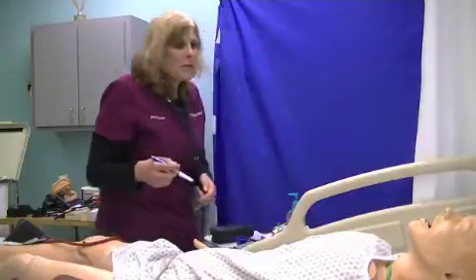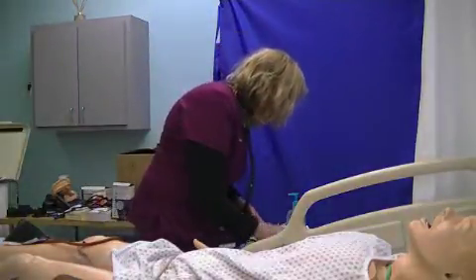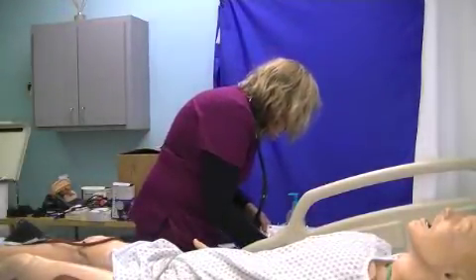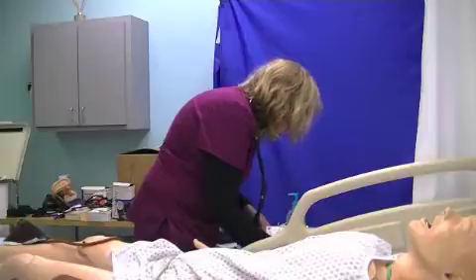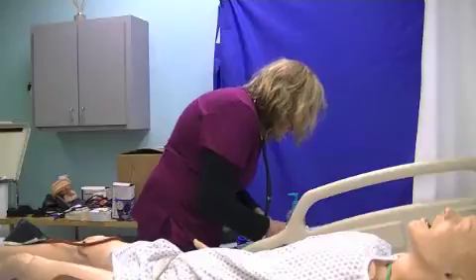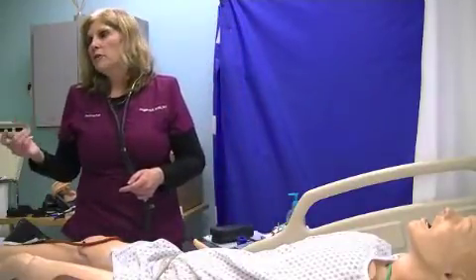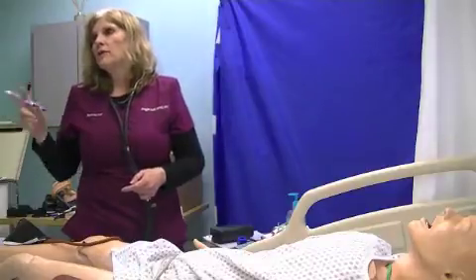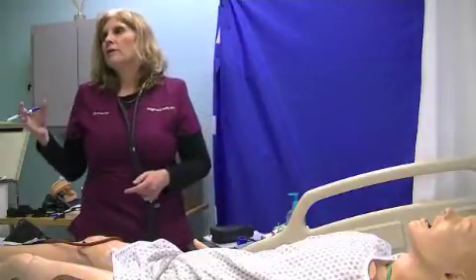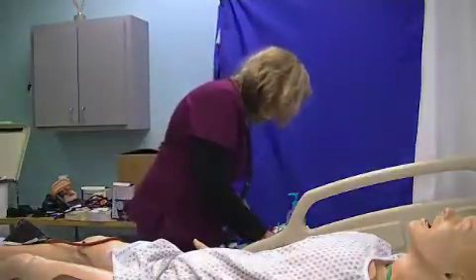Since this is the first time I saw you, I took your blood pressure in both arms, and we used the highest reading. But since this is my second time seeing you, I don't have to do it in both arms. Now, in order to determine if a person has hypertension, which we can't diagnose, you have to take 2 separate readings at 2 different times. And you take both arms, and chances are there's going to be about a 10 millimeter mercury difference between both arms.